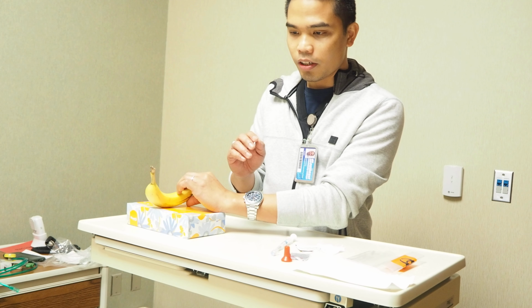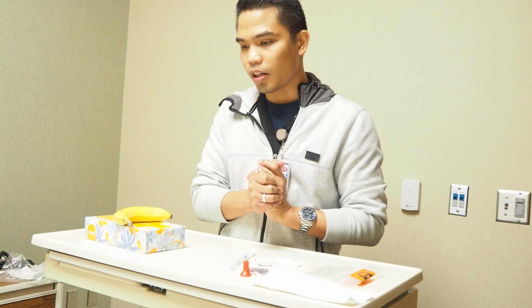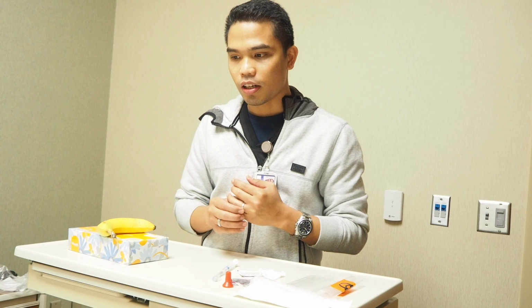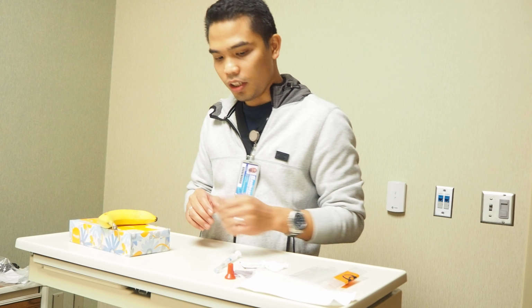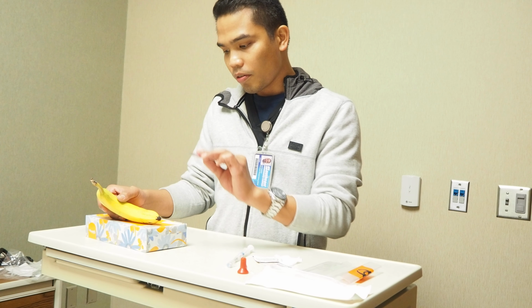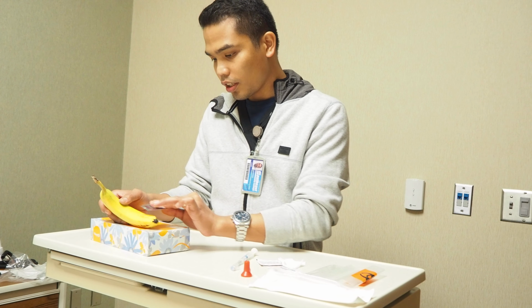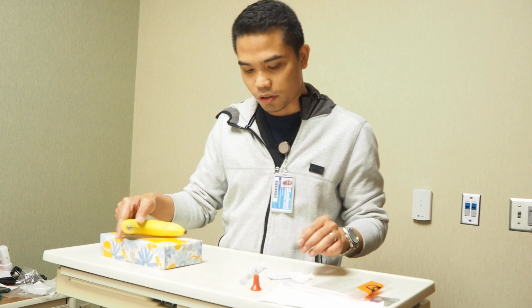Before I proceed, by the way, I have to put on proper PPE by wearing gloves, and if possible goggles or even a mask. Once I'm ready to proceed, I'm going to take this alcohol prep pad, and when cleaning the patient's wrist, you should do it in a circular motion, not upside down, and then throw it all in a proper waste disposal.